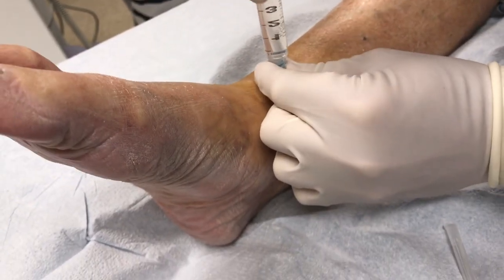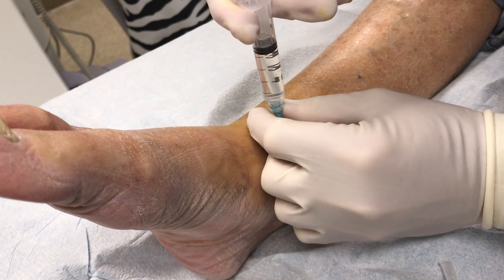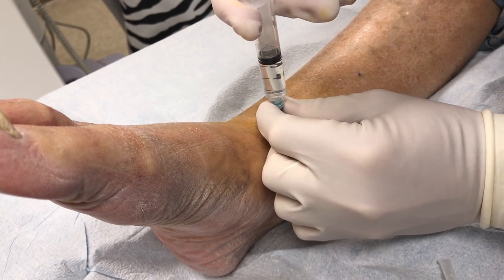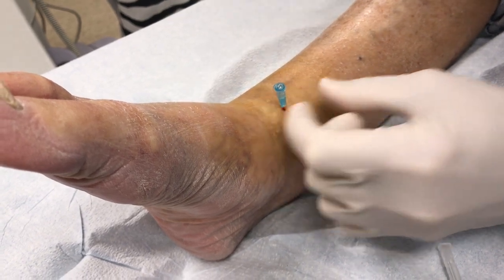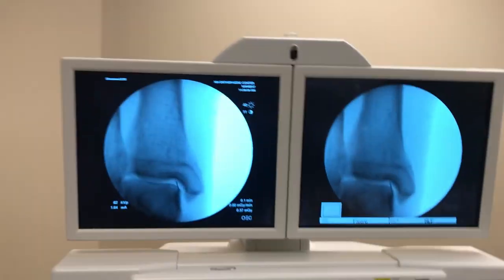I'm going to go down inside the joint. You can see the needle go down there — nice, no resistance to my injection. So I know that I'm in the joint. We'll just take an X-ray. Perfect.